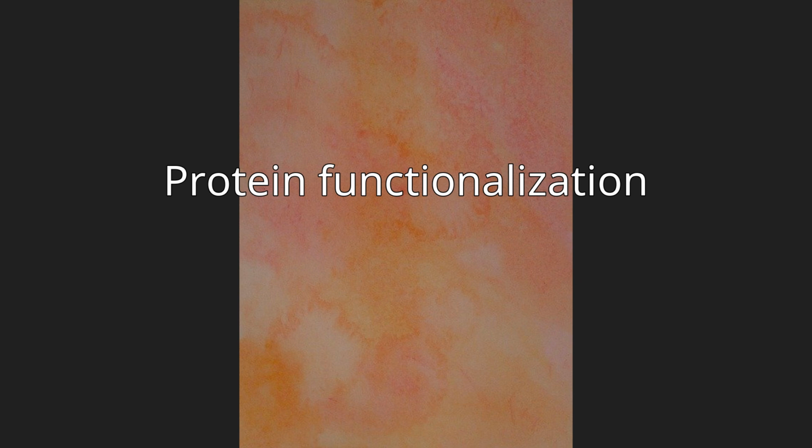36-37. It has also been shown that peptides can be selected to specifically support neuronal growth or glial growth, and that peptides can be deposited in patterns to guide cellular outgrowth. 38-39-40. If populations of neurons can be induced to grow onto inserted electrodes, electrode failure should be minimized.